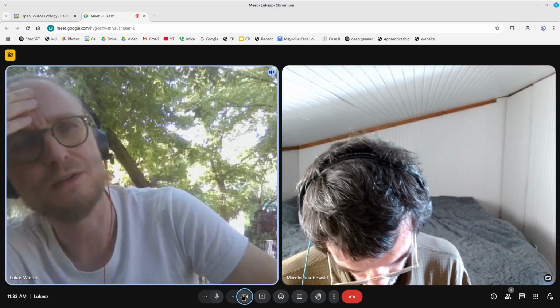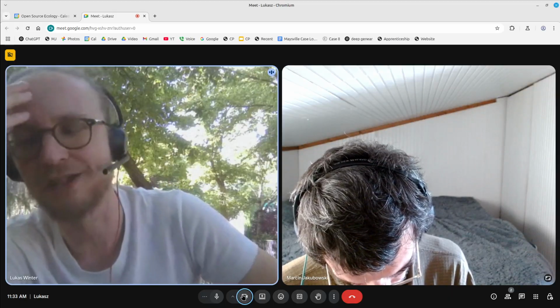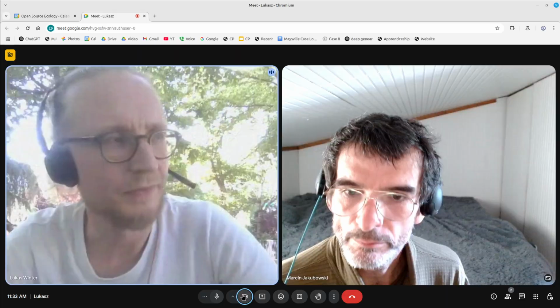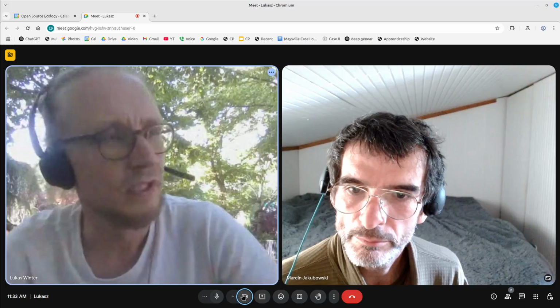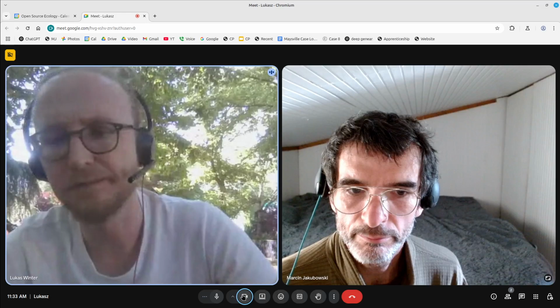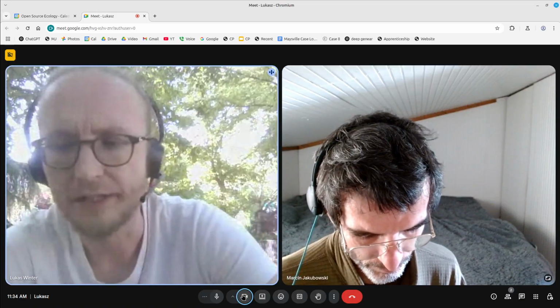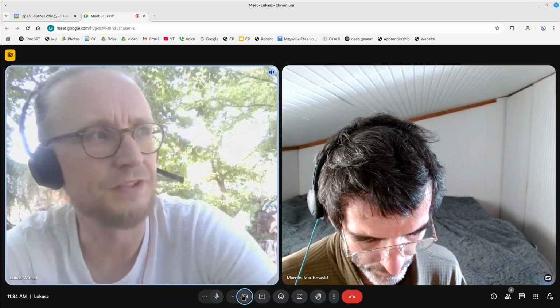I don't want to say you don't have to worry, but you don't need to worry as much as in high field systems: the magnetic field, the RF power deposition, the gradients, acoustic noise. There are so many things that are much easier, which makes it pretty cool. But of course you need to do your homework and cannot have any obvious threats.